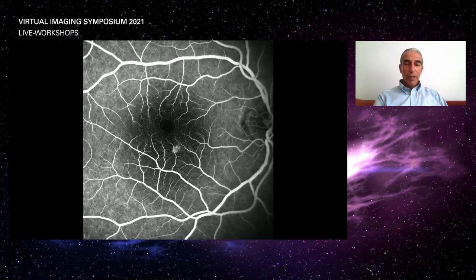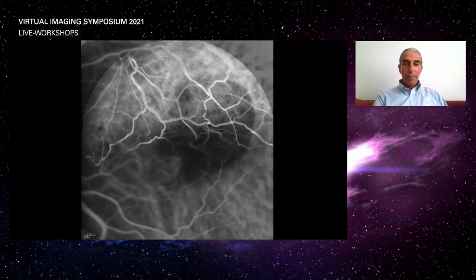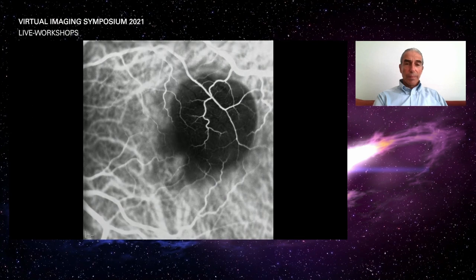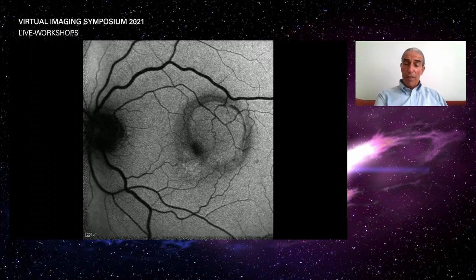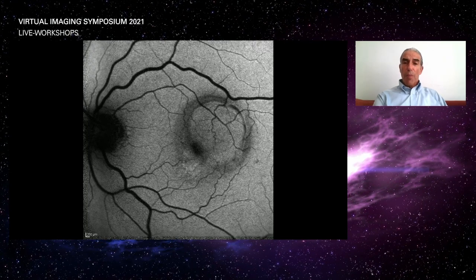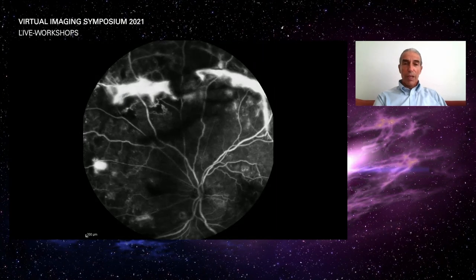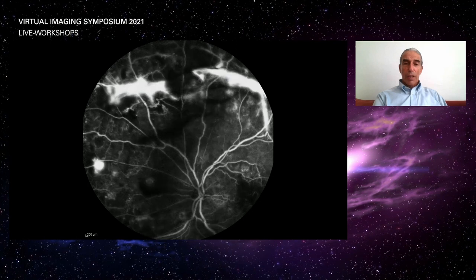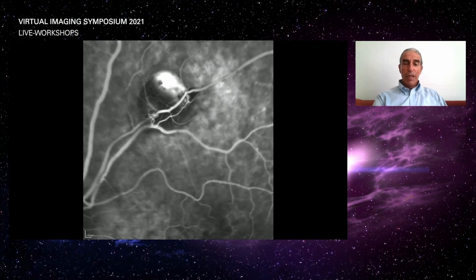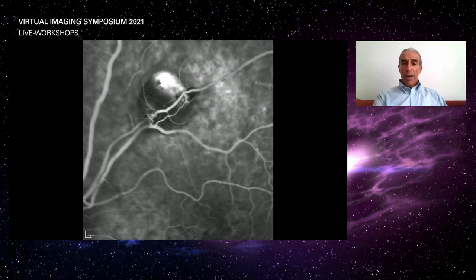By using a PowerPoint highlight, ICG showing a retinal detachment, ICG showing a pigment epithelial detachment, autofluorescence. When you have extreme elevations, we can use autofluorescence for the same effect if the internal components of the elevation are autofluorescing, of course. Fluorescein with, of course, neovascularization in the vitreous and a vitreous hemorrhage. Fluorescein, I think just about the end, might have one more, showing a macroaneurysm which bled.